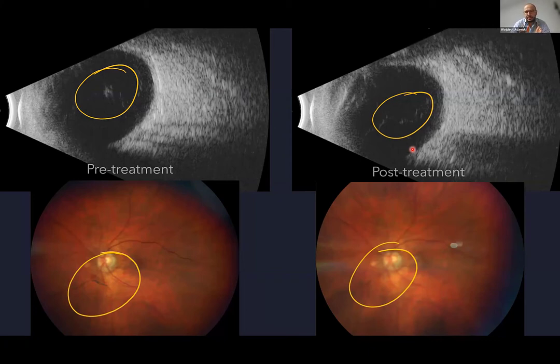In terms of documenting the process of treating the patient, so saving some images of a patient pre-treatment and post-treatment, I don't really think that's the best option because, as I mentioned, we can do this examination in such a way that it either shows or doesn't show those floaters. So it might not be the best way to document and confirm the treatment.